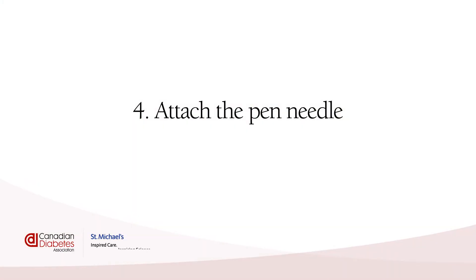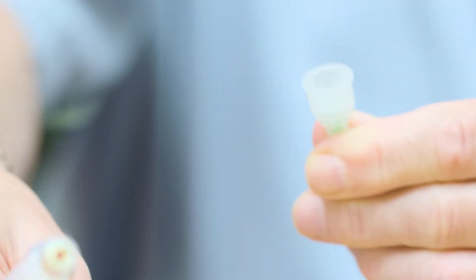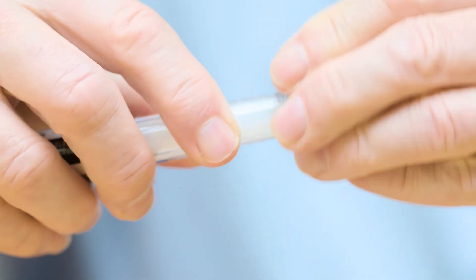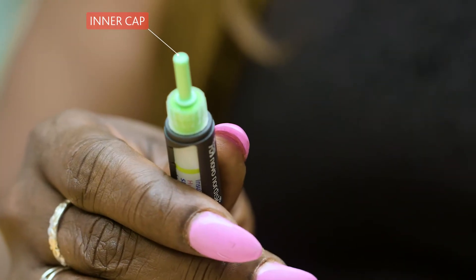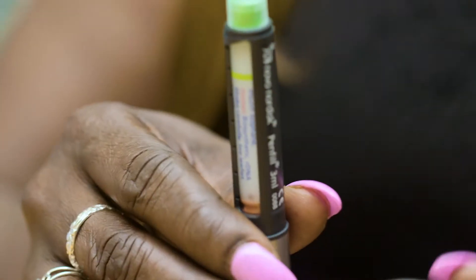Attach the pen needle. First, you will remove the seal from the needle. Then line up the needle with the pen. Keeping the needle straight, screw the needle onto the pen. And remove both the outer and inner cap. Keep the outer cap for later when you remove the needle. Once your needle tip is on, your pen is almost ready.